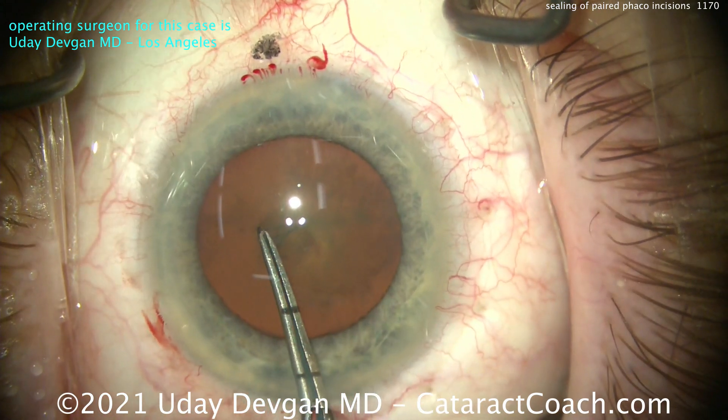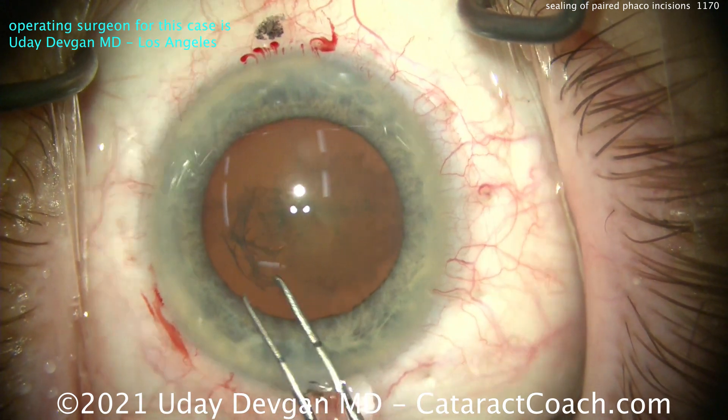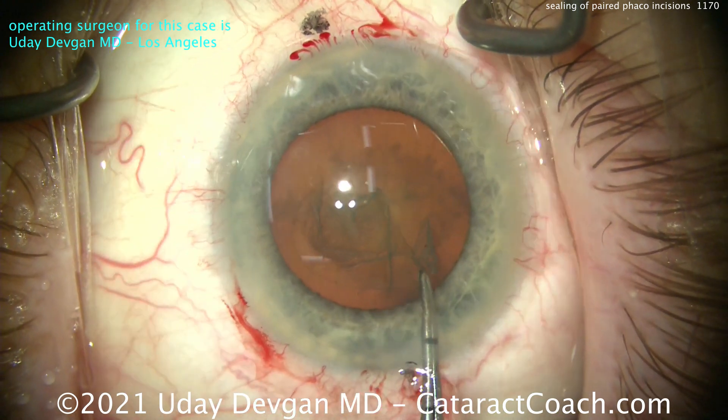We'll do the surgery. And the question is: do we need to seal up, hydrate, or do anything special to that extra incision — that one you see there at the top of your screen, which is nasal?